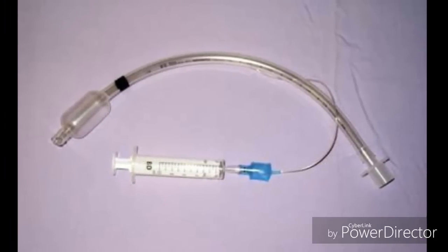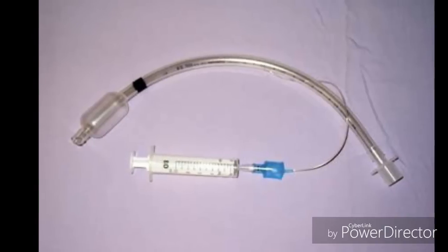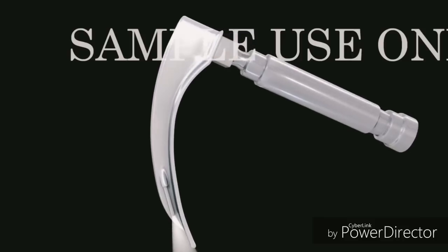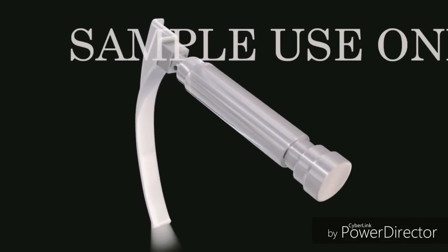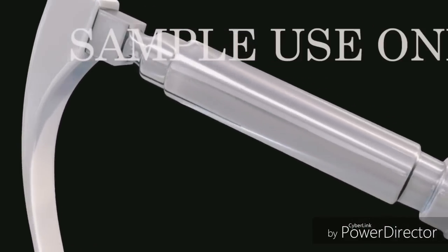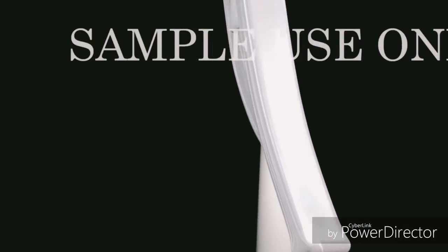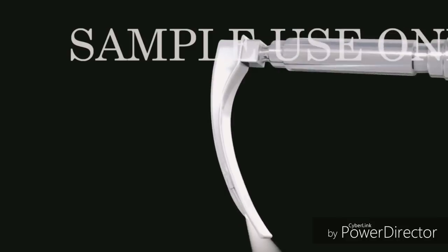To perform the process of intubation, basically two things are required: first is the endotracheal tube, and the second is the laryngoscope. The laryngoscope has two parts — the handle and the blade with a point source of light.